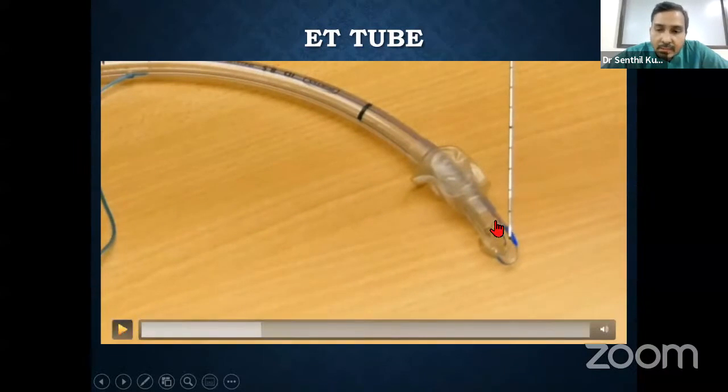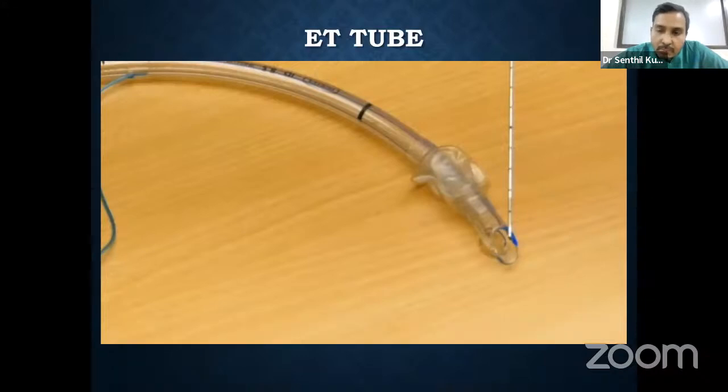The second thing is the bevel. Usually in all normal conventional Portex tubes, the bevel will be facing on the left side. So whenever we are intubating, the principle behind intubation is we are going to put the laryngoscope, push the tongue towards the left side, create adequate space to visualize the vocal cord, and we have to hold the tube in such a way that you are holding the tube in the distal third.